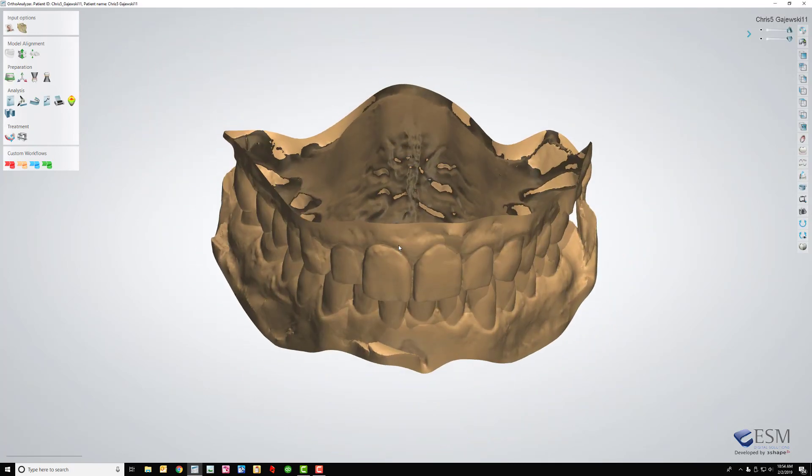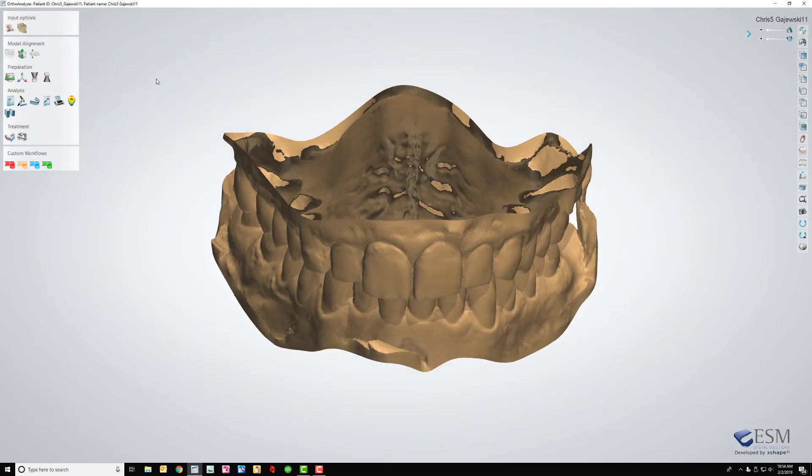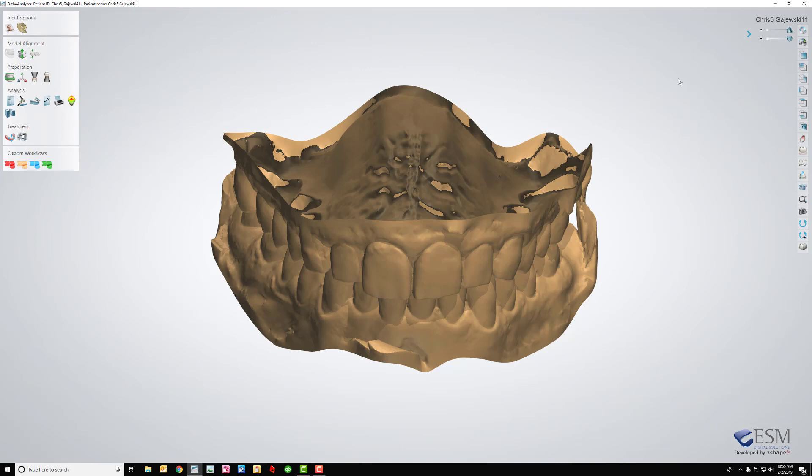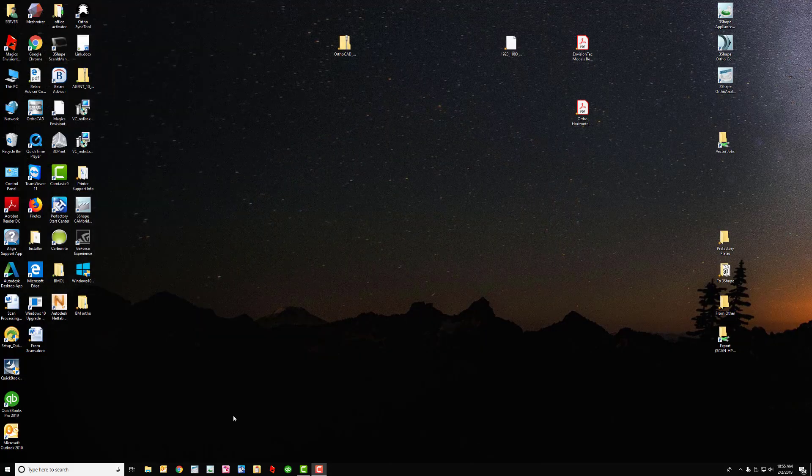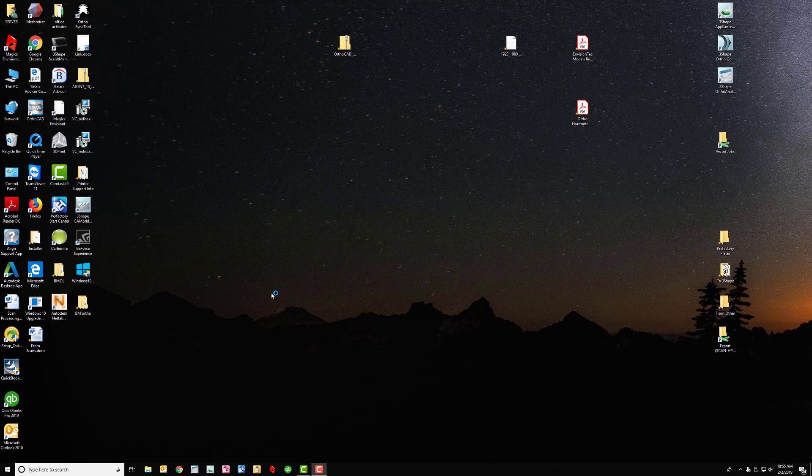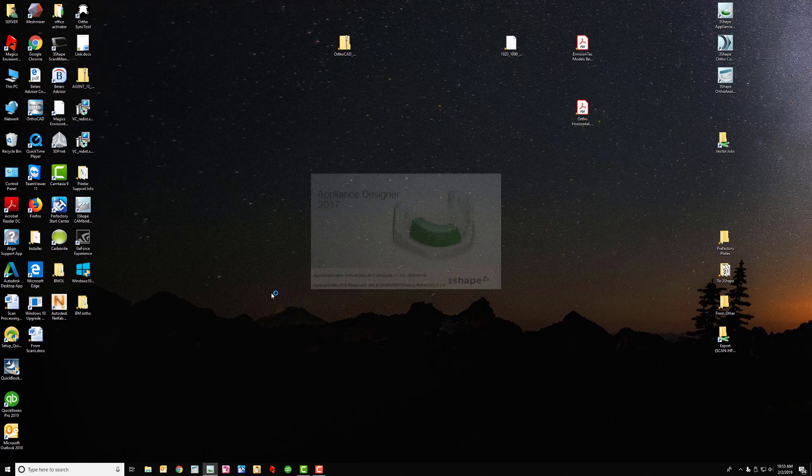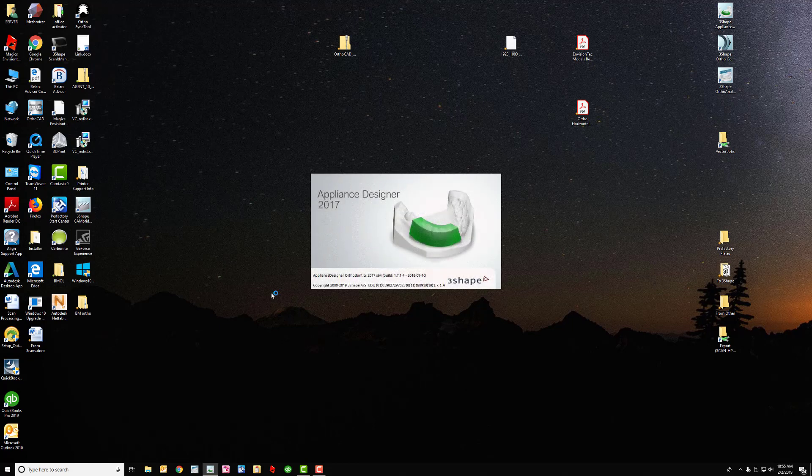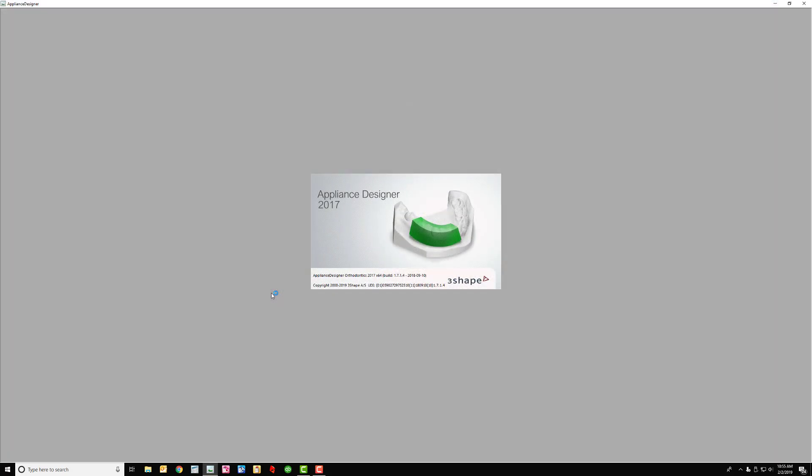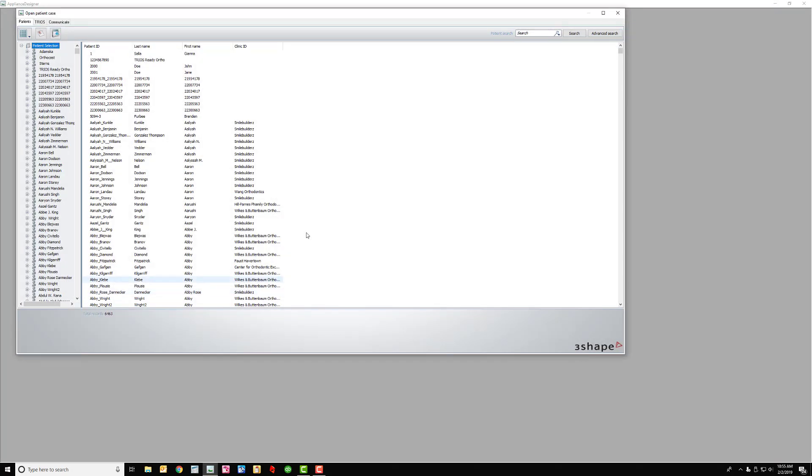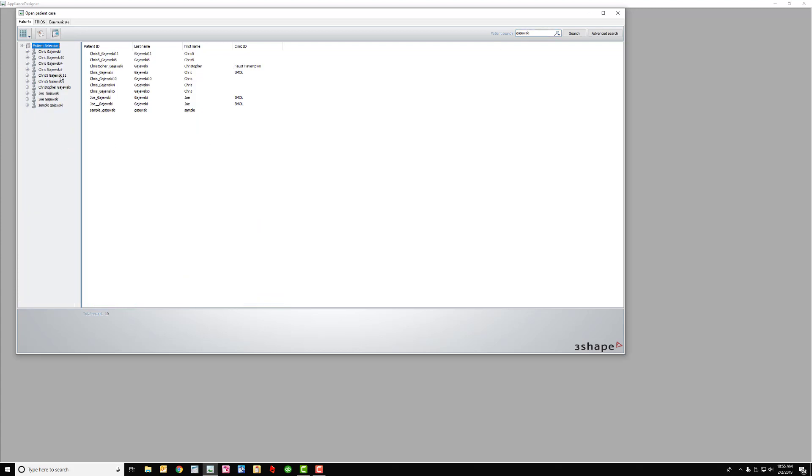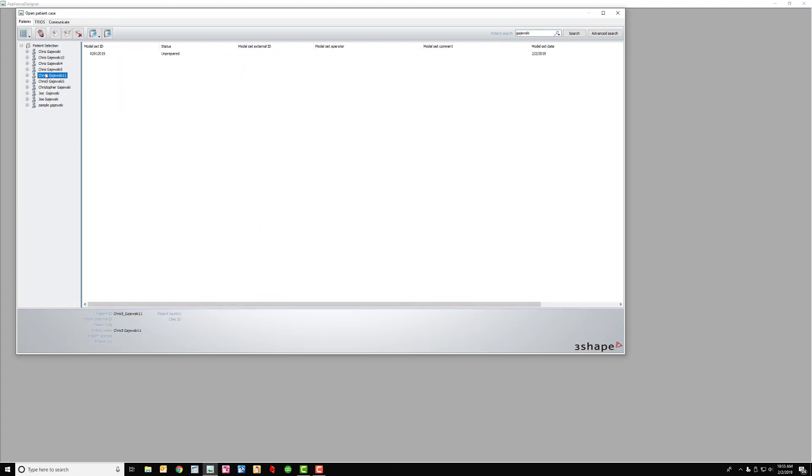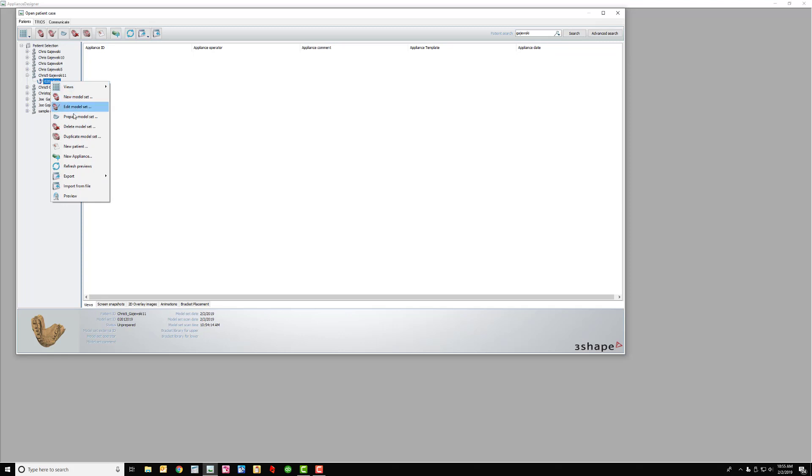So after this gets done, this is all loaded. I would typically just click on here in Orthoanalyzer to create a new one, but since I don't have any more I'll just get out of that and I'll open up Appliance Designer. And this is going to take a couple seconds. And then I just search for Gajewski.